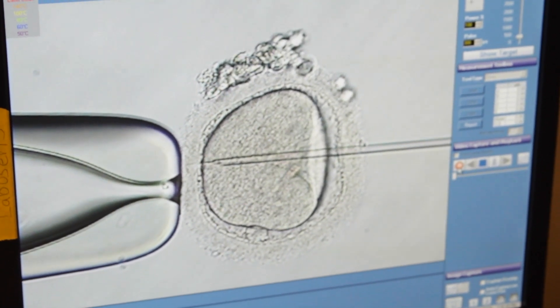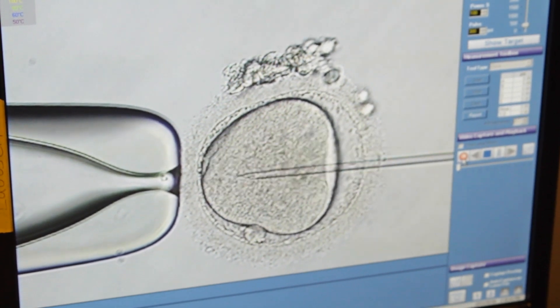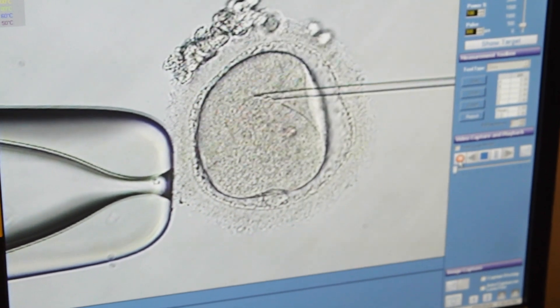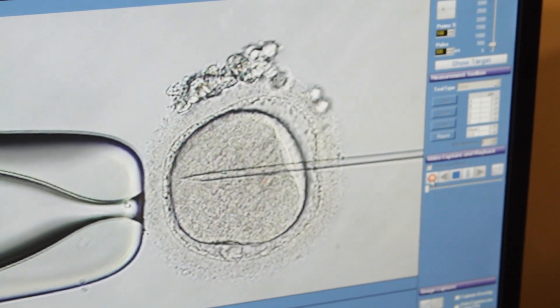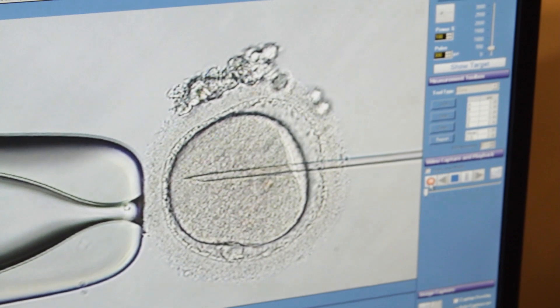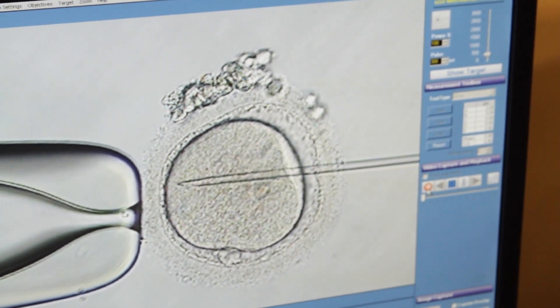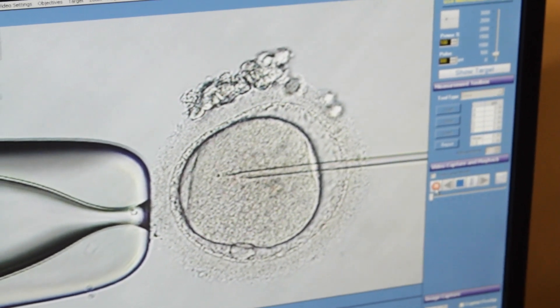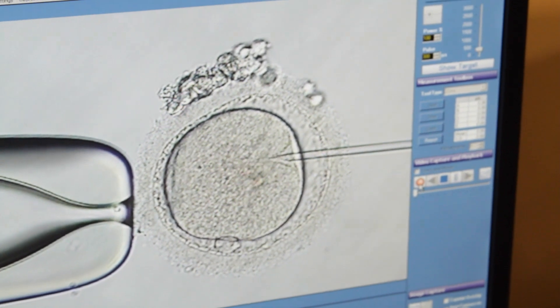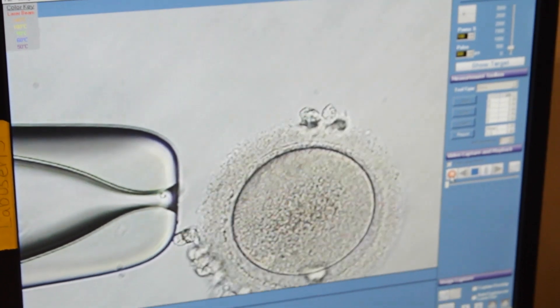Here at RMA of New York, we use a very gentle way of breaking the oolemma, which is the membrane of the egg. That's what Donna's doing there with the circular motion. We don't actually break it by sucking in the ooplasm, which is the standard method. Due to this, we have very low damage rates with ICSI, while other labs contend with up to five percent.